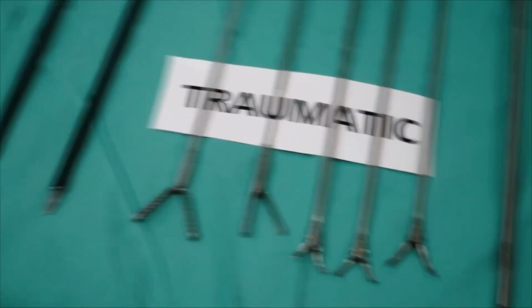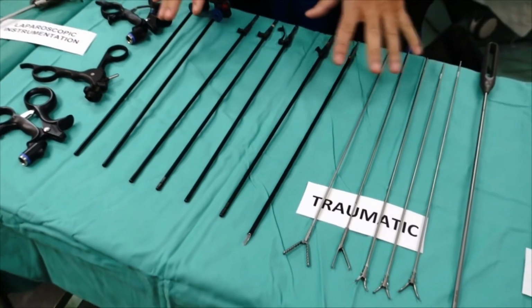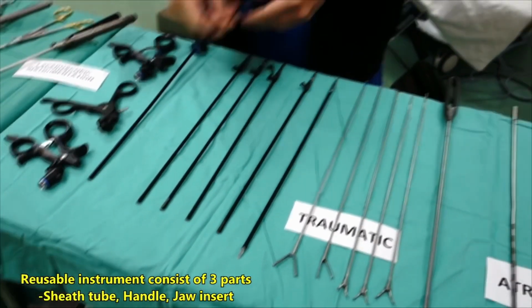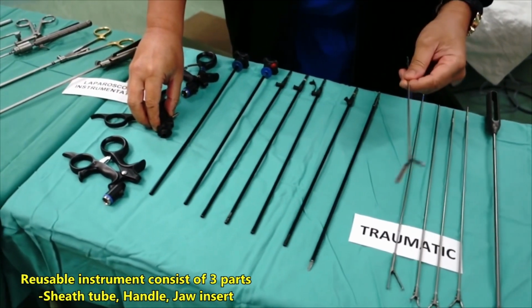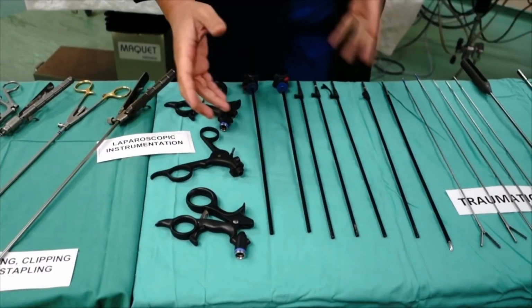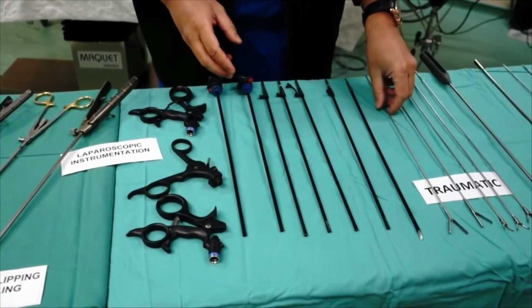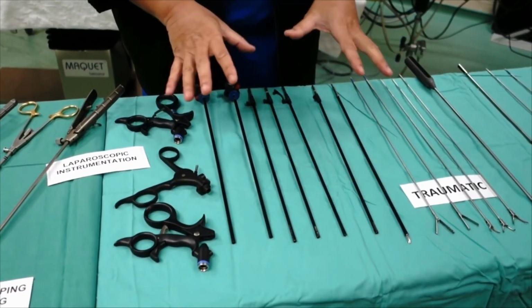Now, I just want to share with you that reusable instruments consist of three parts. They have the tube, the handle, and the insert. So you can actually buy all these instruments separately. Most of the time the handle is the most durable part of the instruments, and the insert and the tube are usually the parts that you need to change.